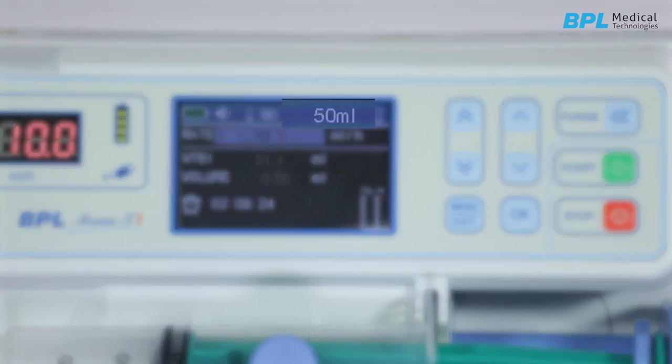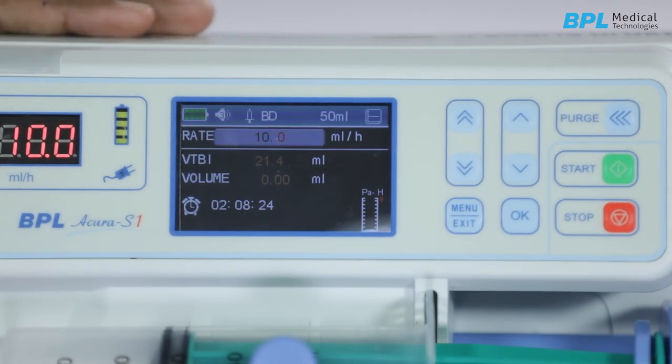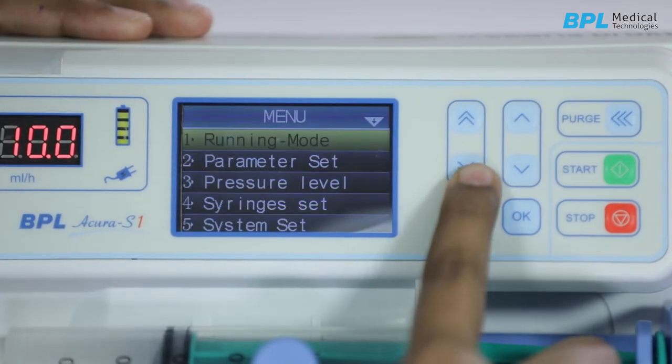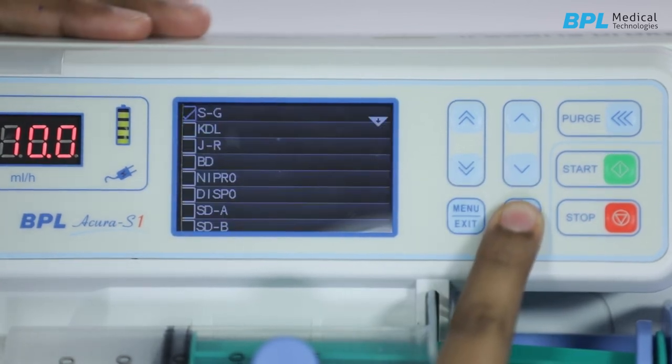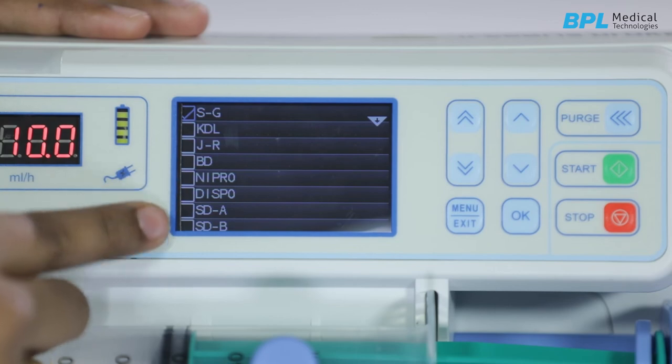The display will show the volume size of the syringe — please check if it is correct. You can select the syringe brand by entering the main menu. In the syringe set menu, you can select the brand of the syringe being used. Then proceed to selecting the infusion mode.